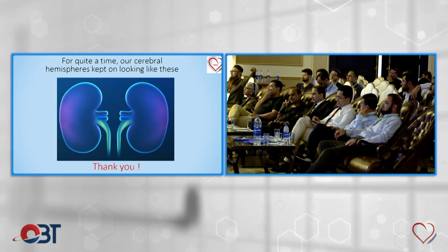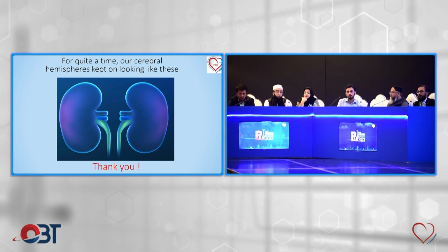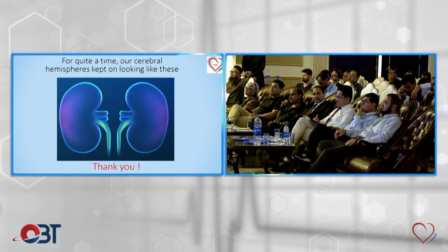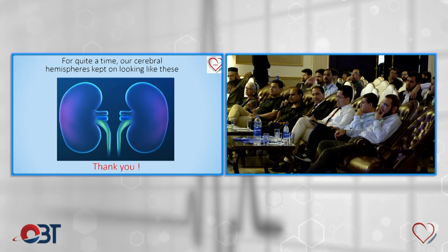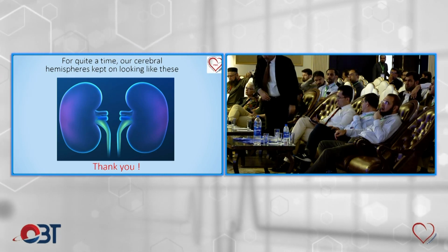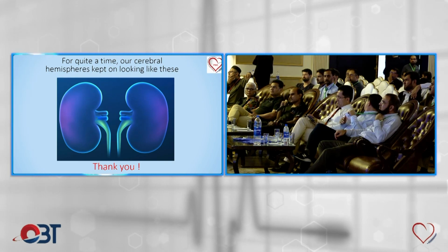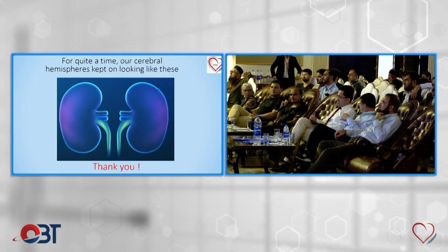And what was the second? I was asking about the data, how frequently such procedures are performed globally. We are planning to case report this one, because there is only one case report on left main LAD and circumflex nano crush with zero contrast. There is no other case report in any other territory, and we will make it the first case report of LAD diagonal nano crush with zero contrast, hopefully.